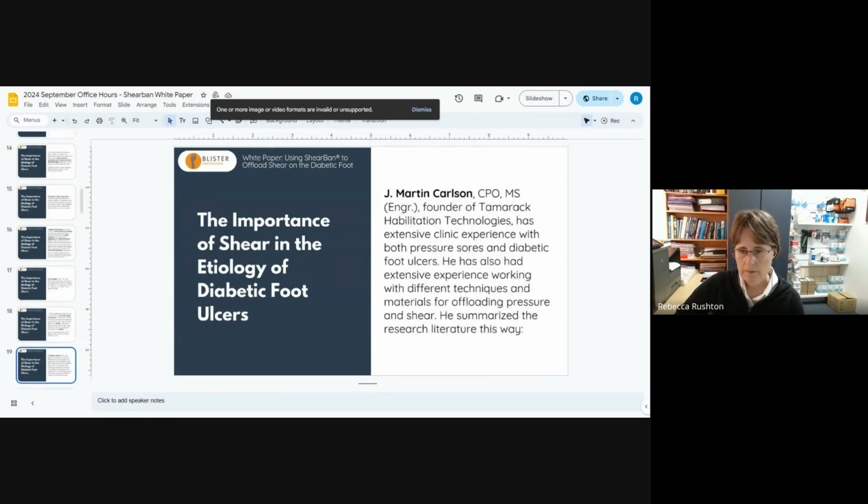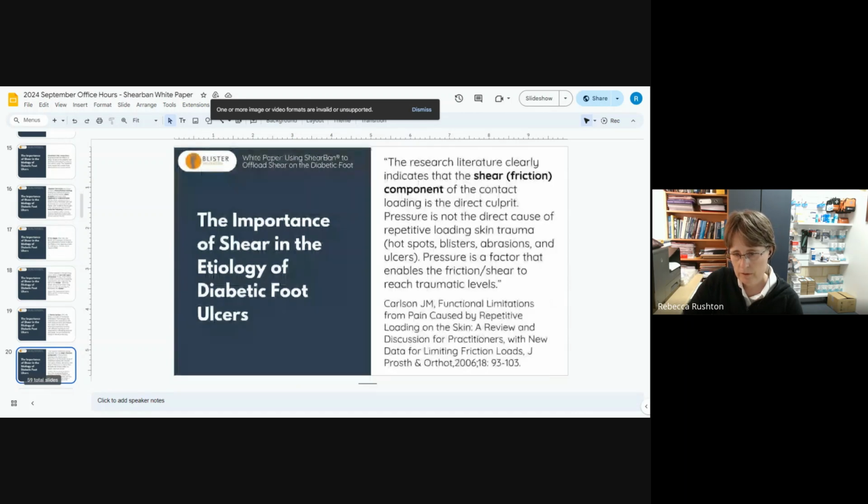Marty Carlson, founder of Tamarack, has extensive clinical experience in pressure sores and diabetic foot ulcers. He's also had extensive experience working with different techniques and materials for offloading. So this is the guy that made Engo and ShearBan. He summarised the research literature in this way.